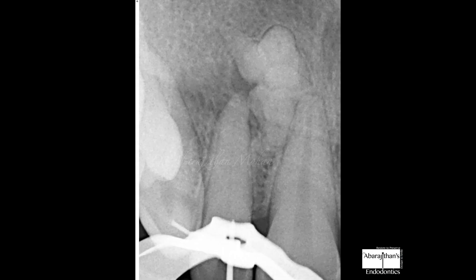I confirm the direction before drilling by keeping my DG16 at the purchase point and taking a radiograph. You can see here that my DG16 is here whereas the canal path is here — so I stop at the right point and change direction immediately. If you don't keep taking radiographs after drilling, you may end up perforating. After almost every one to two millimeters that you drill, you need to take a radiograph until you reach the patent canal.